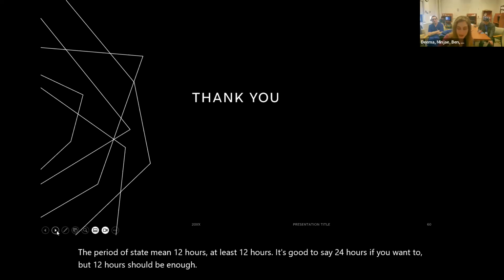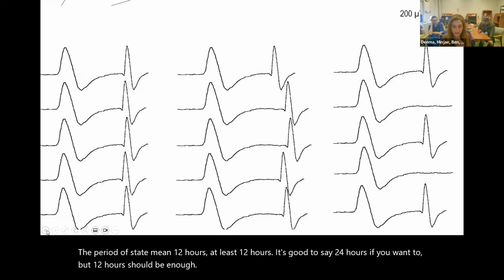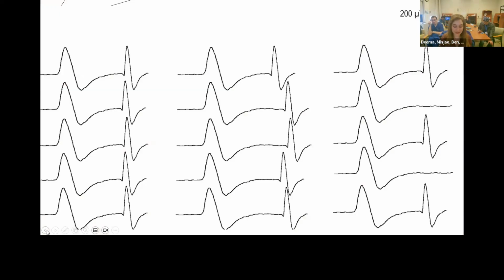Thank you so much. The other question is about single fiber EMG. We know that for a patient who is ocular negative with high suspicion for myasthenia gravis, we refer them for single fiber EMG. But what are other scenarios? For example, can we use it to diagnose suspected botulism, or myasthenia gravis other than ocular findings? What's the utility of it?